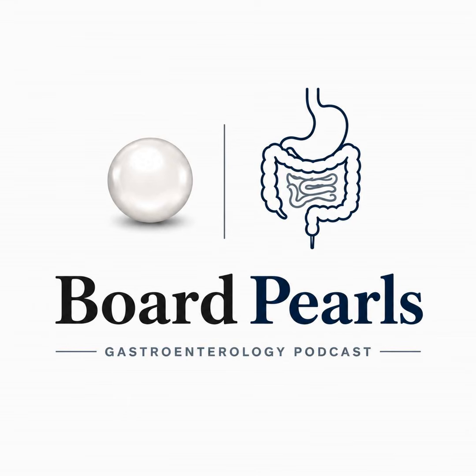The dominant nodule is a focal area larger than the surrounding granules. That nodule is where the risk concentrates. The dominant nodule is therefore the en bloc target within the lesion. Non-granular flat elevated lesions carry roughly 5% risk.